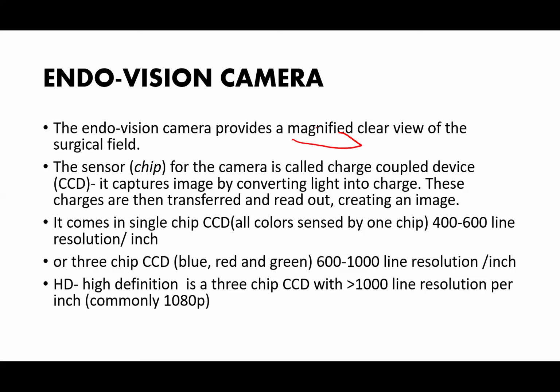Now, it comes in single chip CCD. That means it has only one sensor and all the colors are sensed by a single chip. And the resolution is 400 to 600 lines of resolution per inch for a single chip CCD.